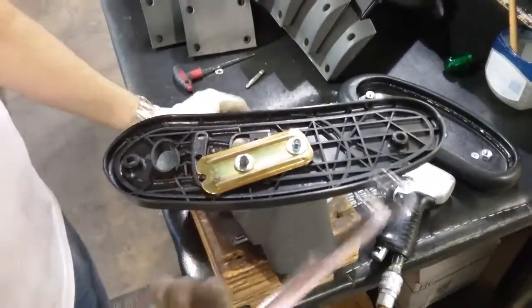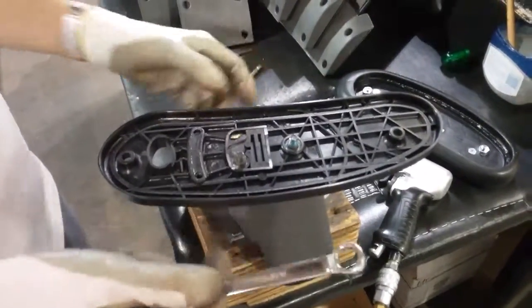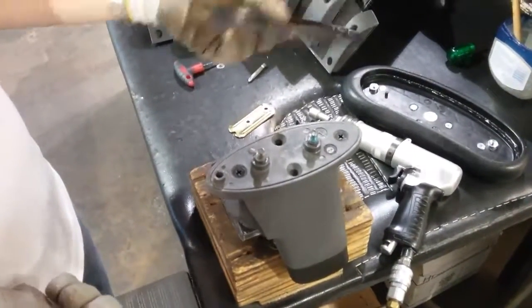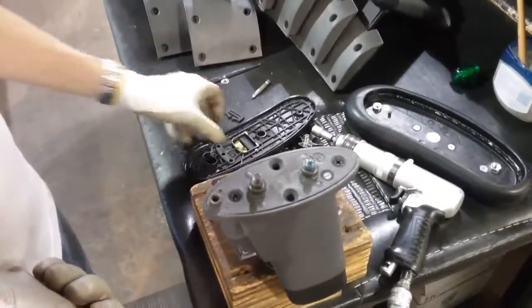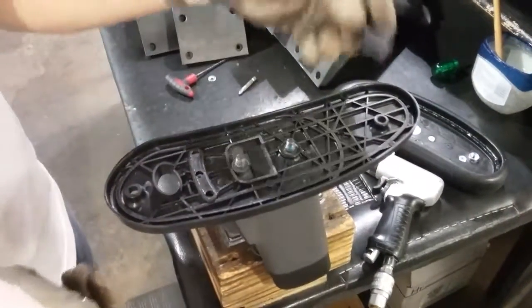Once those 2 bolts are taken out, you're going to remove that plate. And you're going to lift the bottom of the arm pad. Now, when you put your new arm pad on, you're going to put the bottom of that arm pad plate back on. And put your plate on top.